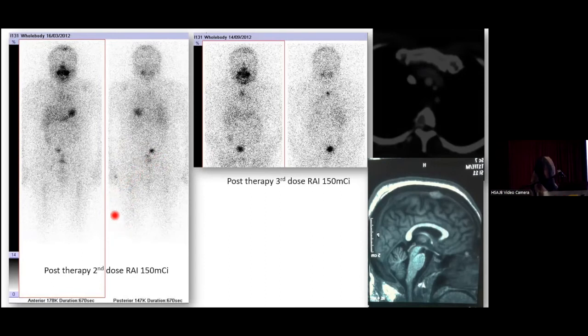So we need to know what we are going to do for this patient, because he's very young, very energetic and productive. So we actually had a tough time getting an appointment for a CT scan, where finally we know that from here, actually there's a very mild uptake here in the midline, more prominent posteriorly.